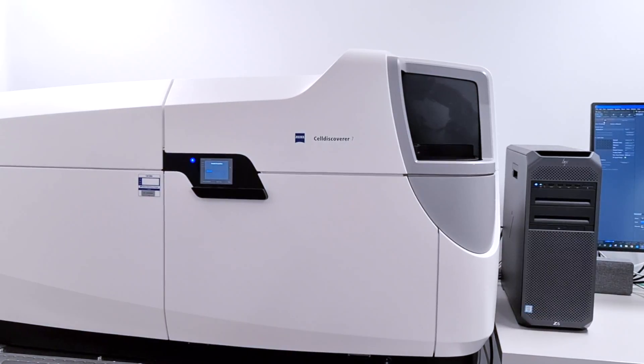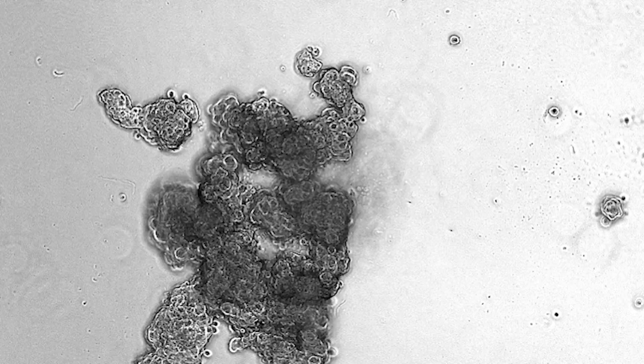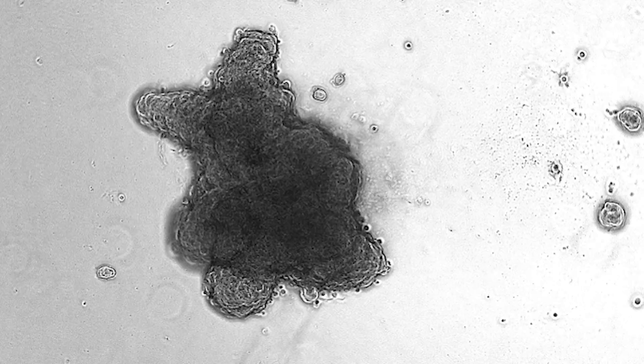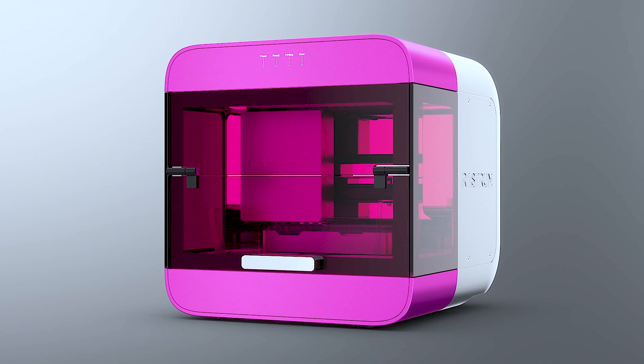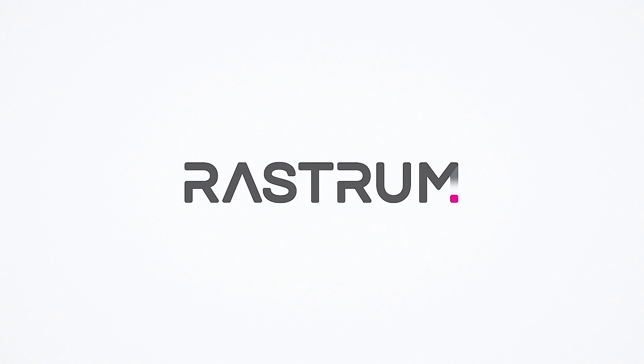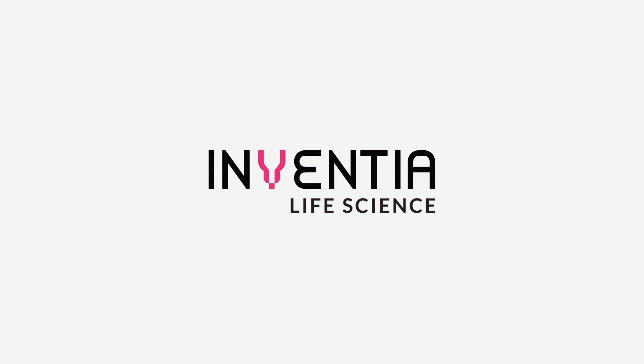Rastrum hydrogels allow users to conduct downstream analysis with minimum interference. Accelerate your research and make complex 3D cell cultures simple with Rastrum, a revolutionary 3D cell biology platform from Inventia Life Science.